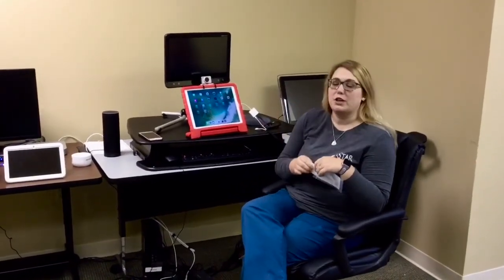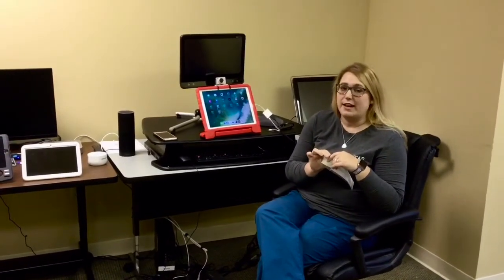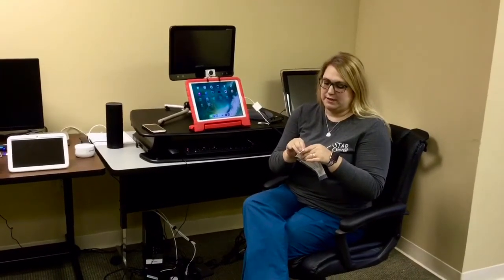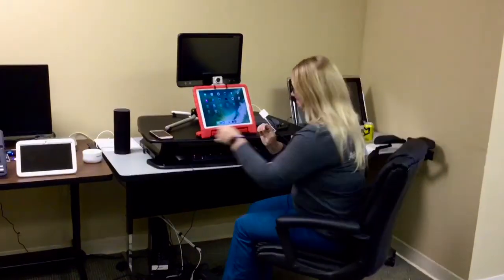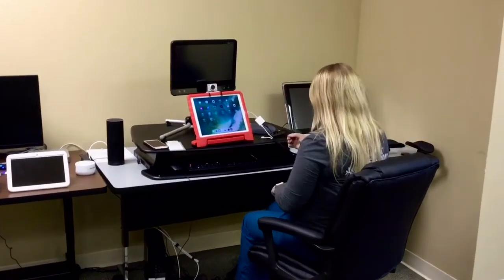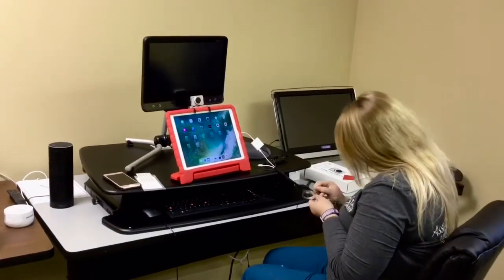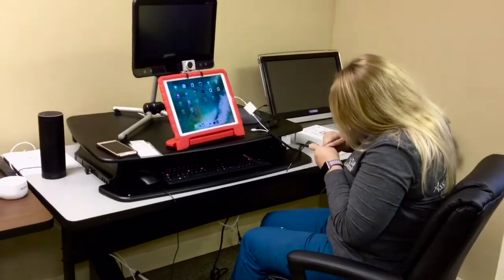So we're going to demonstrate Jabberwocky, which can also be used on the newer iDevices that have facial recognition, kind of like the eye gaze. I'm going to put one of these on my own glasses because I can't see the screen otherwise. They're sticky. They're really sticky. Okay.